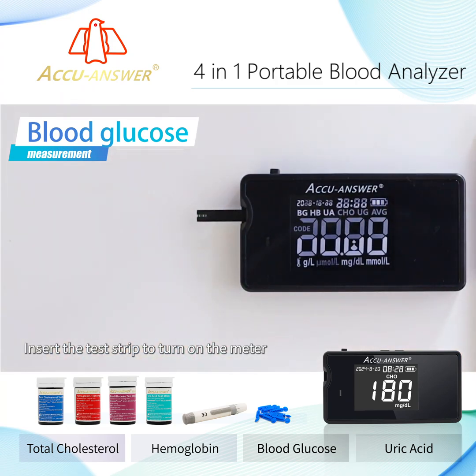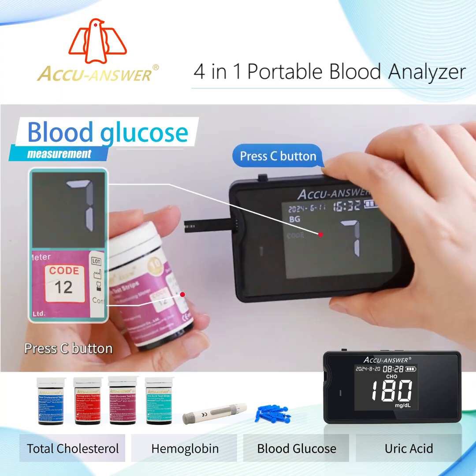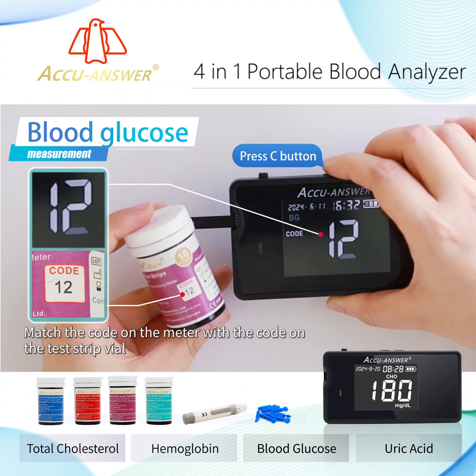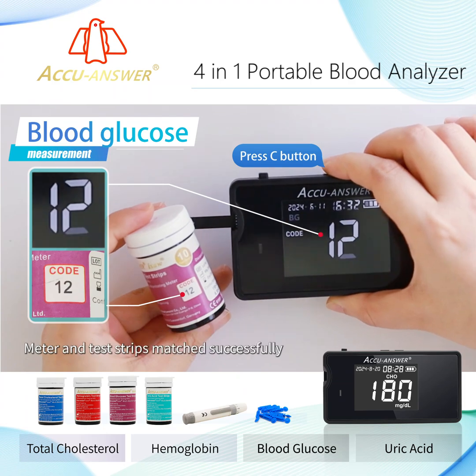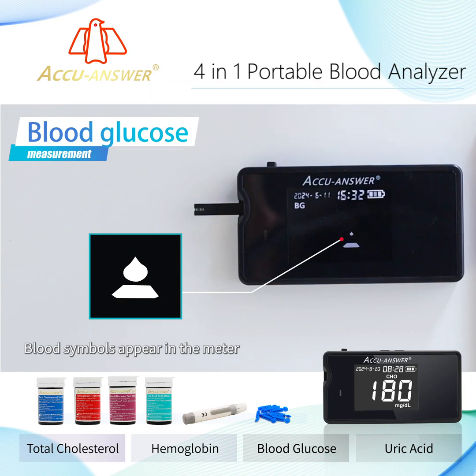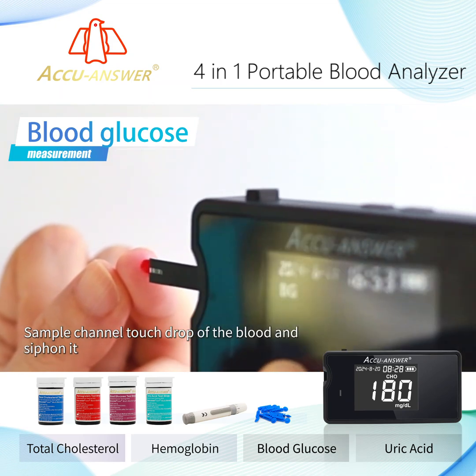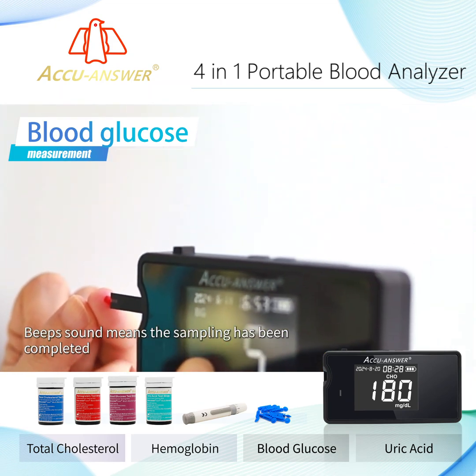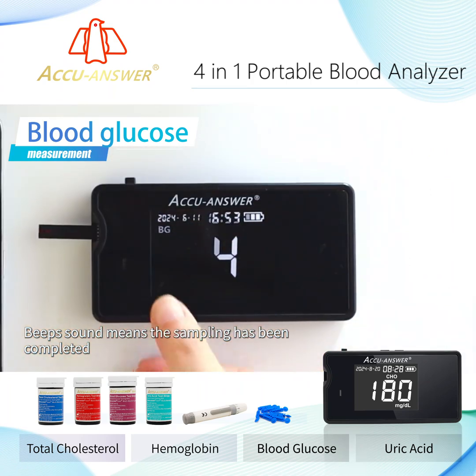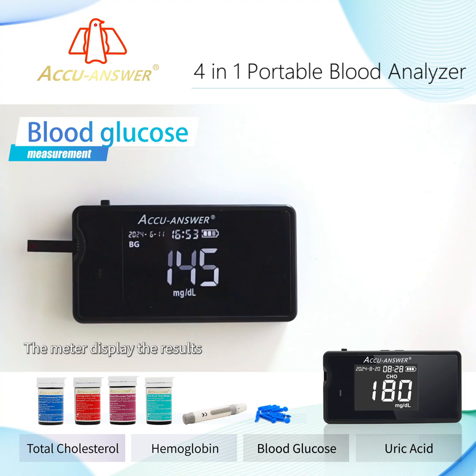Insert the test strip to turn on the meter. Press the C button and match the code on the meter with the code on the test strip vial. Meter and test strips matched successfully. Blood symbols appear on the meter. Apply the sample — the sample channel touches the drop of blood and siphons it in. A beep sound means sampling is complete. Wait for the countdown to end and the meter will display the results.